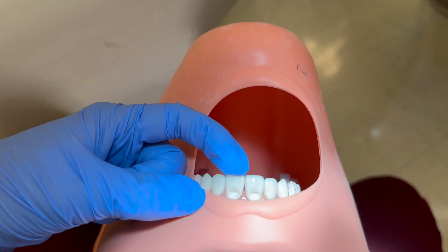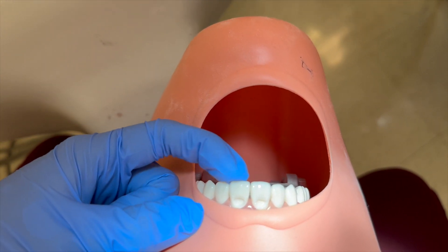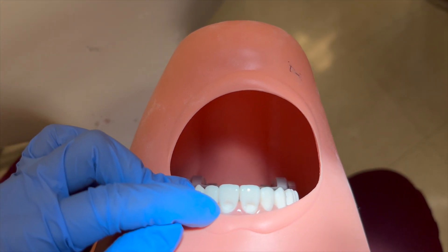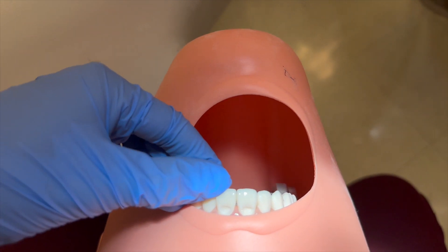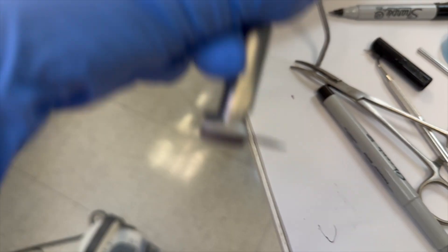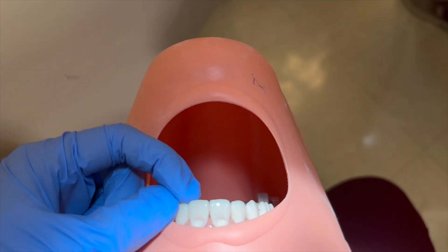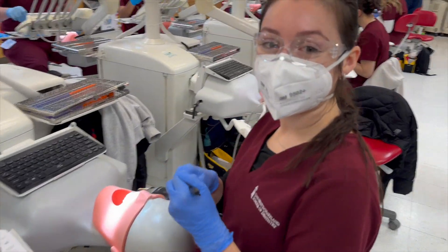Here I have number eight and number nine prepped with the bevel. I did improve from number eight to number nine — my number eight prep was a little too small and the bevel was too long. For number nine I got just about the right thickness and width for the prep as well as the bevel. The bevel is kind of hard to see but it's basically just an inclination down that we do with this flame diamond bur. We have to do about six of them by our next class. I've been moving pretty slow just to get a feel for it, but hopefully I can start moving a little faster.